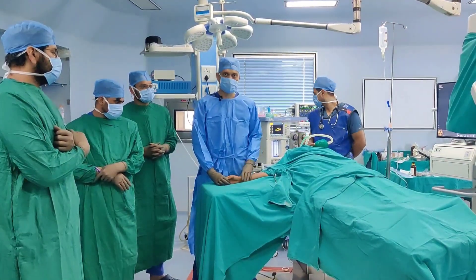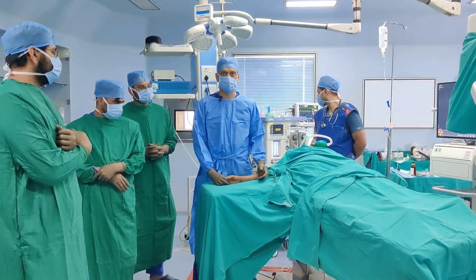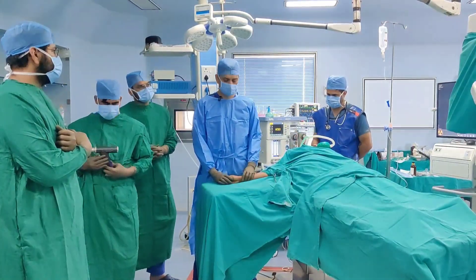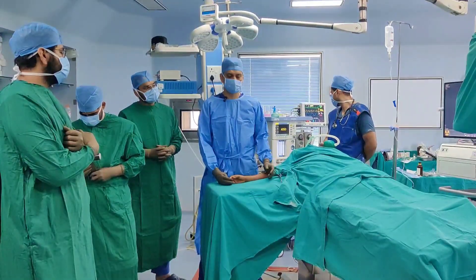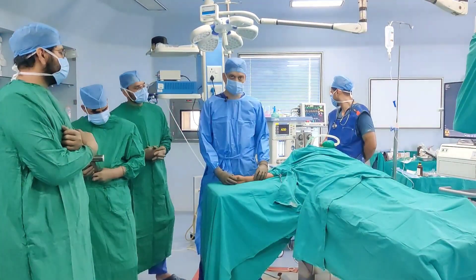There are two ways you can approach this. One is to get everything ready just in case you need the wire, and the other option is to reduce the fracture and then paint and drape. I think having everything ready works out easier because if you need a wire, you do not risk losing the position of reduction and you can pass the wire pretty much straight away.